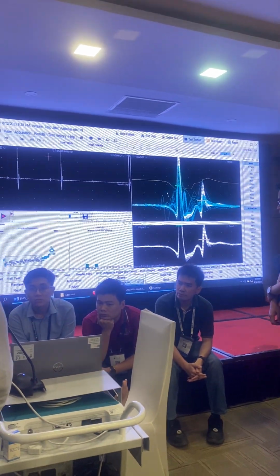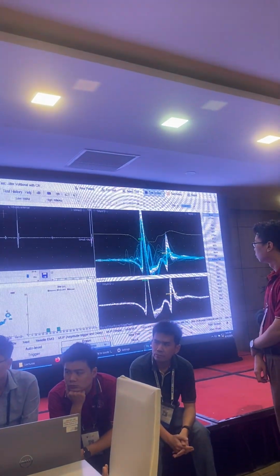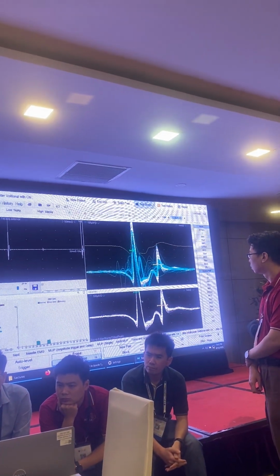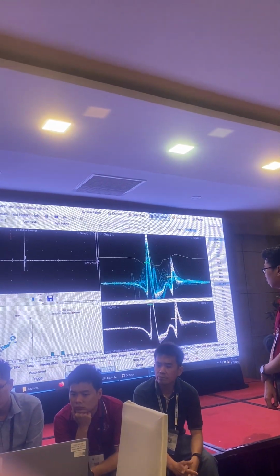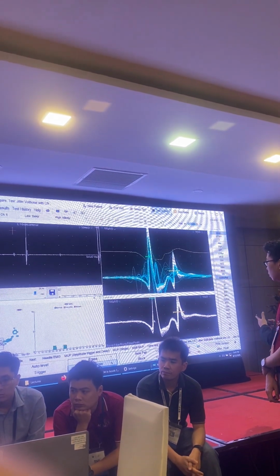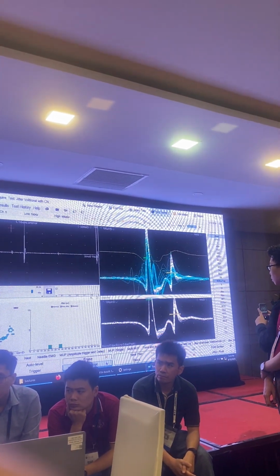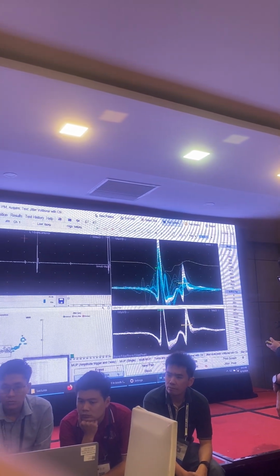So you can see at the top, this is what we recorded, and you can see there is so much noise, interference, and other things. This is what I analyzed. So this is your quality control. When you look at the bottom window, that tells you what you have analyzed, and that should be good quality. Okay. Let's record from another side.